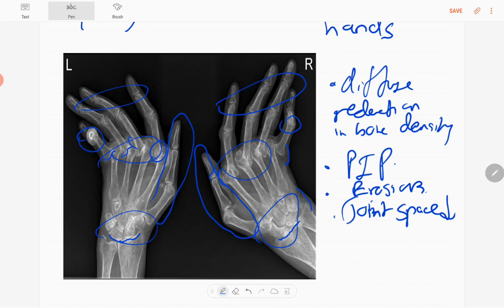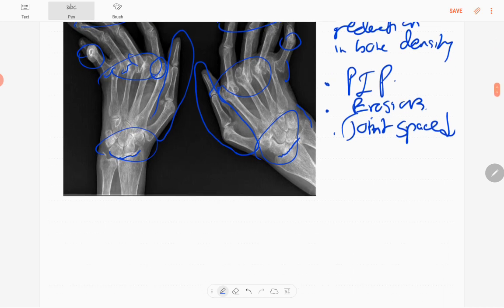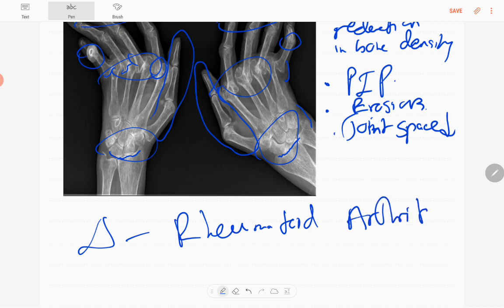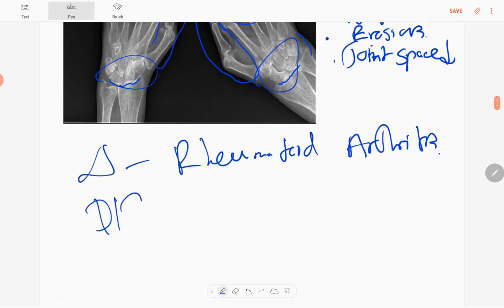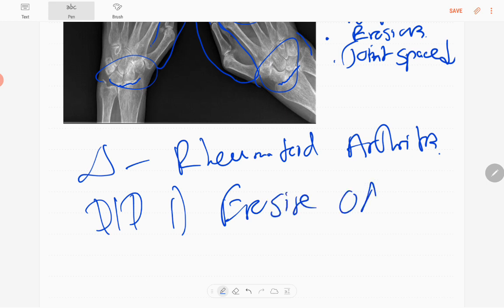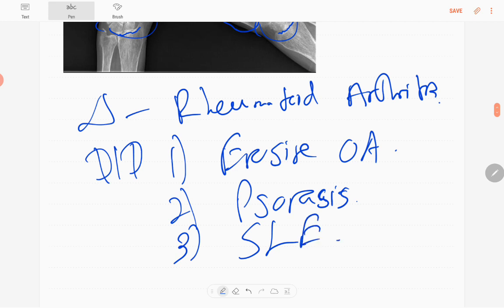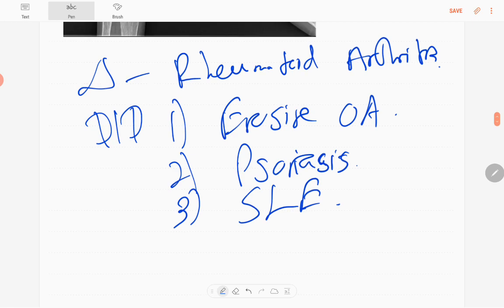There are no fractures. The diagnosis in this case is rheumatoid arthritis. For differential diagnosis, you can consider erosive osteoarthritis, psoriatic arthritis, and SLE. These are a few differential diagnoses for rheumatoid arthritis.